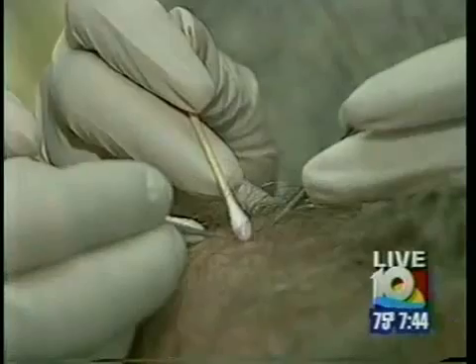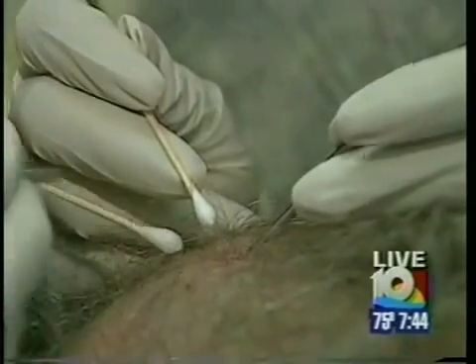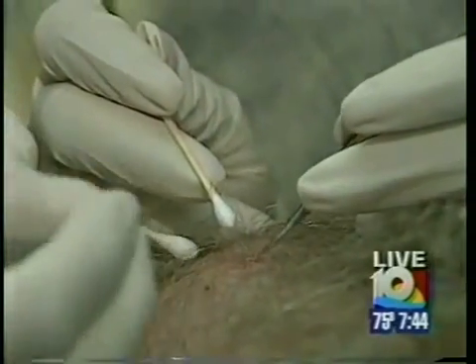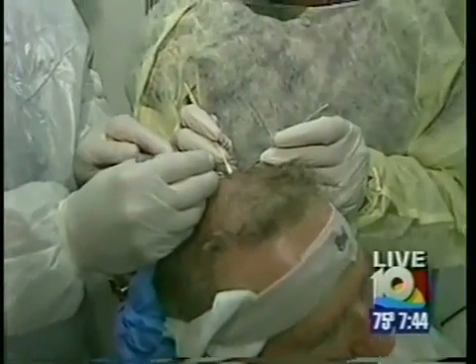We want to head back out to Elaine Lucadano. She is telling us all about some new laser procedures that can help people who are losing their hair. Hi, Elaine. Hey, we've been growing hair all morning, and this is so amazing. We've shown you a little bit how the laser works, and basically just poking tiny little holes. It's painless and no blood, and we like that, so we can even show it to you.